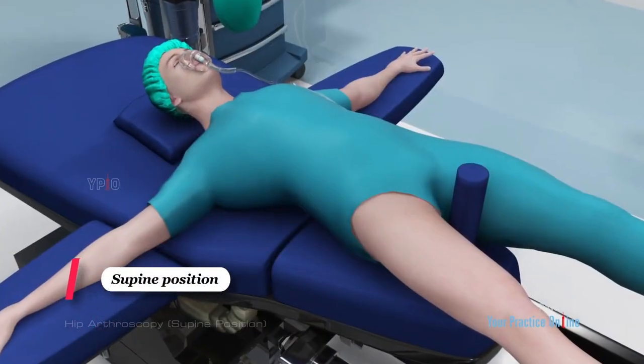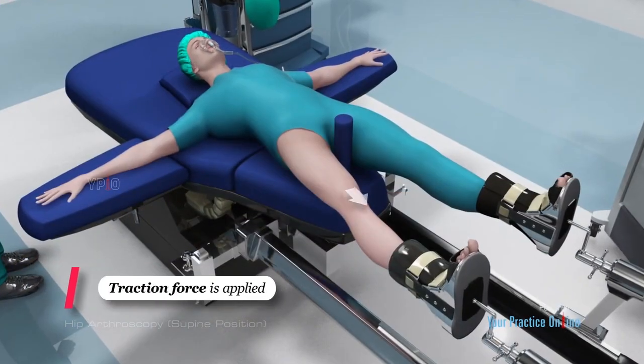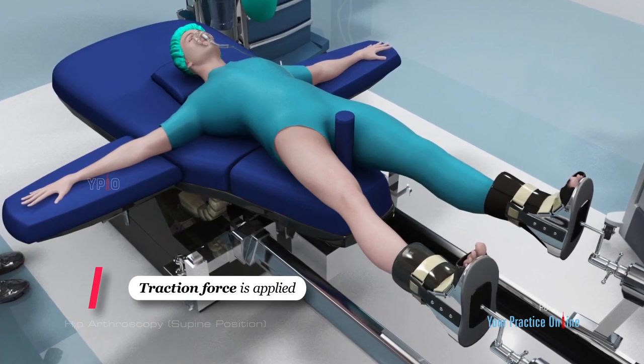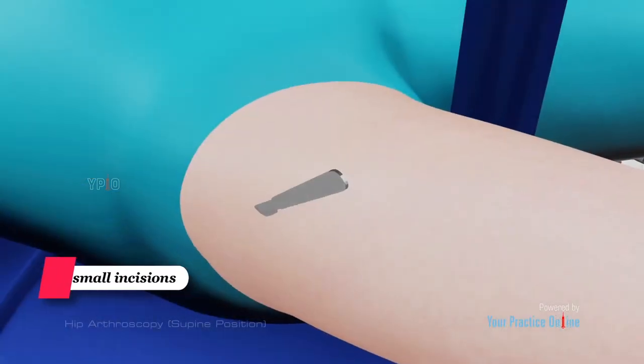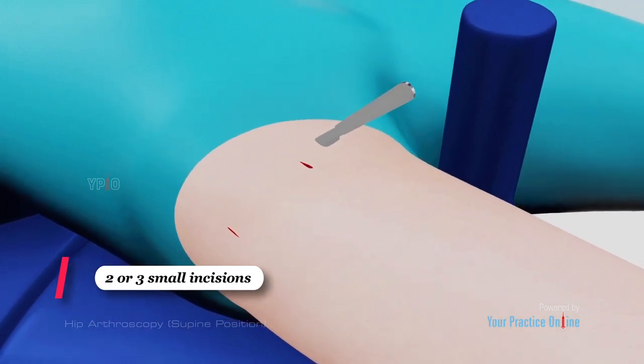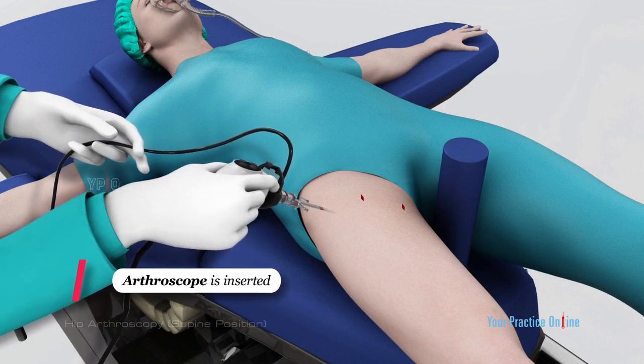You will be placed in the supine position, lying on your back. A traction force is applied to create space within the joint so that the arthroscope can be admitted. Your surgeon will make two or three small incisions, each about a quarter inch in length around the hip joint. Through one of the incisions, the arthroscope is inserted.